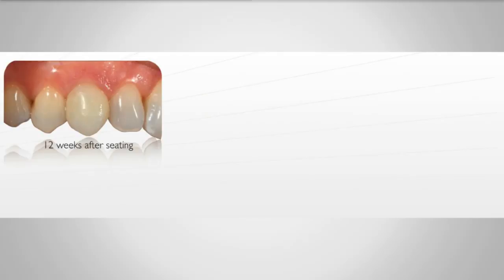Here it is 12 weeks later. You have nice stippled pink tissue, nice circular form, nice papilla levels, and a pretty good blend with the provisional restoration. That's another thing I like about these Visacryls and the Structure Premium N3. I don't customize the colors on the provisionals. You get this nice transition as you go up to the thinner areas. It starts to look translucent, and you get nice colors, and patients have certainly not complained about the color of their provisional restorations.